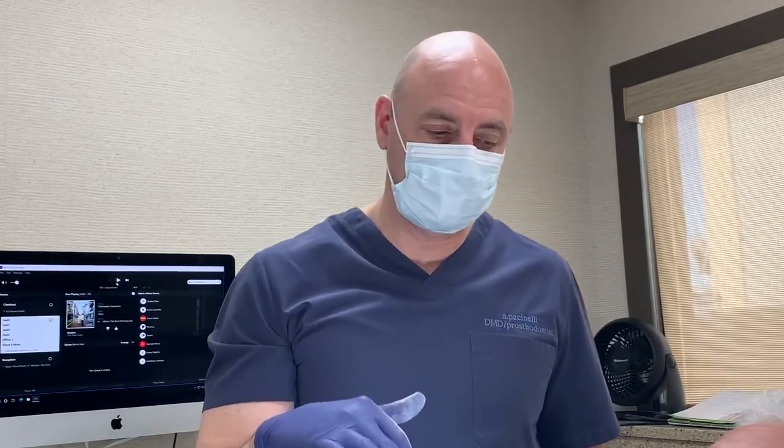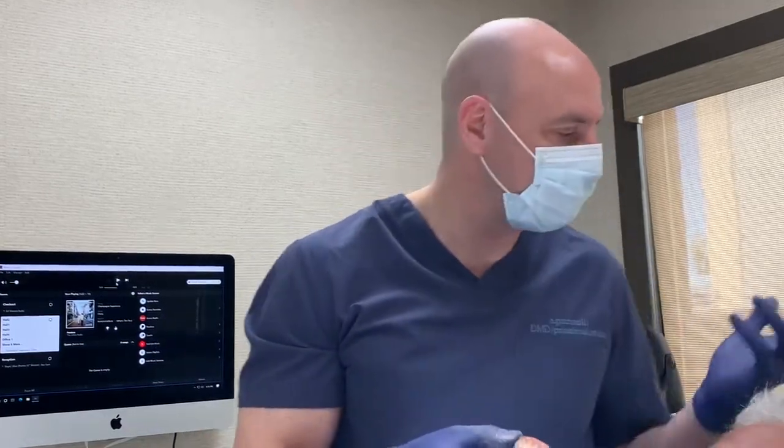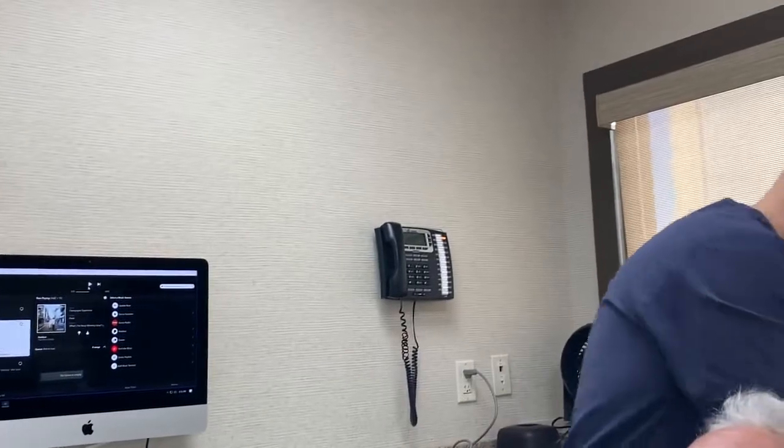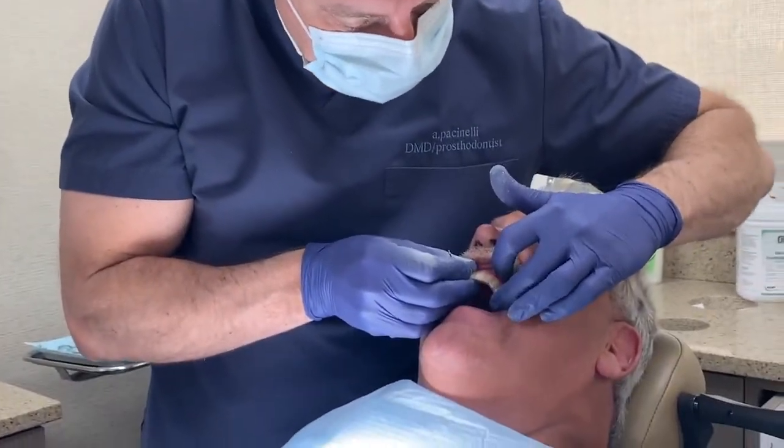If you leave too much of a space, the patient might accumulate a lot more debris and food. It might have an issue with air escape when you're speaking, so they might have problems phonating. So it's a delicate balance: getting it to the tissue where it's closed enough, sealing it off, but they can also clean. That's the name of the game. Yes, and sometimes it takes time. So this material is really nice because it's easy to adjust.